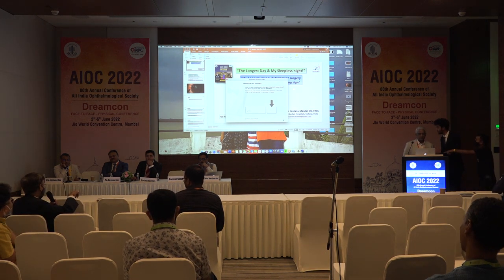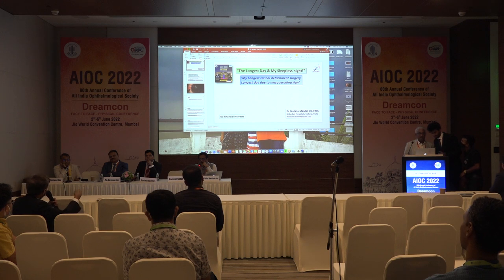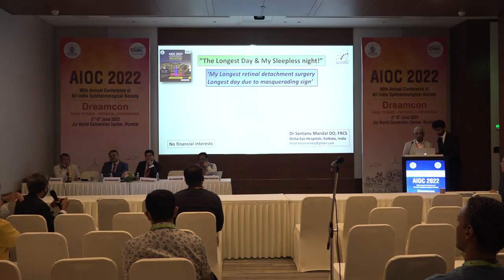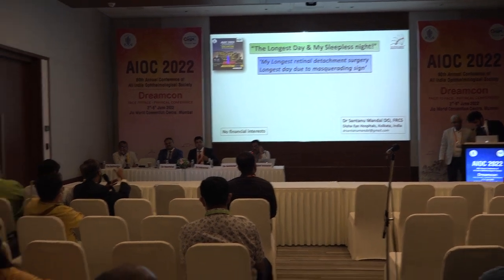And the plane that you mentioned was so important. I have seen a few surgeons with a straight cutter over the membrane. There's no plane, and you hope that only the membrane will cut into the cutter and the retina will not come into it. It will never happen. The retina will also come into the cutter if there is no plane. And that's why it's a struggle, it needs patience, and you need to really learn the technique.